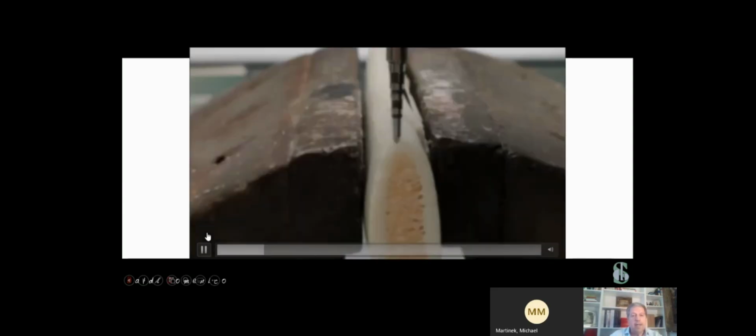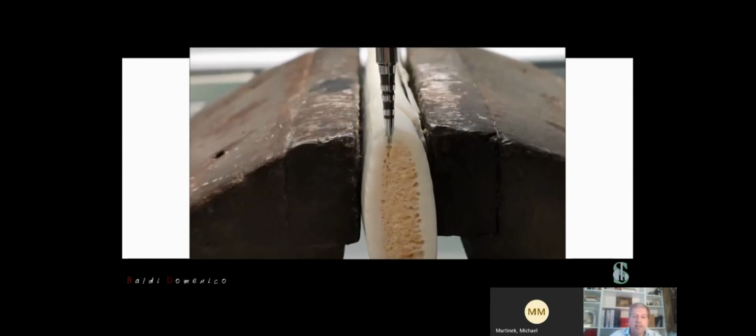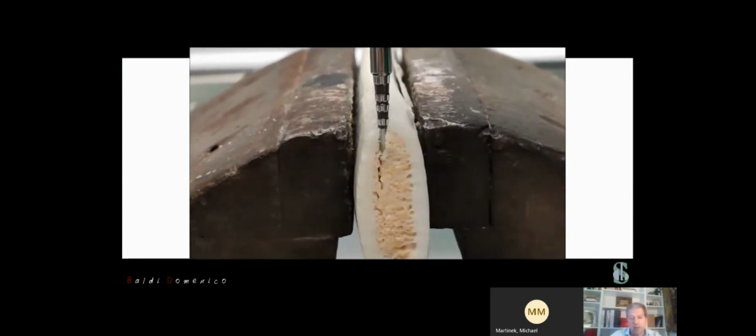In this video, you can understand how this hand mallet works. You can see how difficult it is to manage the forces and how very difficult it is to manage the position of the instrument, how this force can spread in a very, very strong way to the other parts of the bone, creating a crack in the bone.